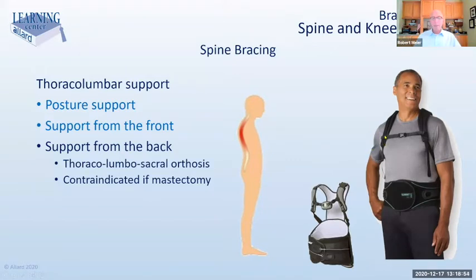So these straps, this type of brace, however, is contraindicated if someone has had a mastectomy, because these straps could put pressure right on the lymph nodes in here, where if someone's had a mastectomy, those lymph nodes have been interrupted already, and we don't want that strap to create additional disruption to the function of those lymph nodes in front of the armpit area. But a really good option for a little bit more advanced kyphotic curve for upper trunk stability.